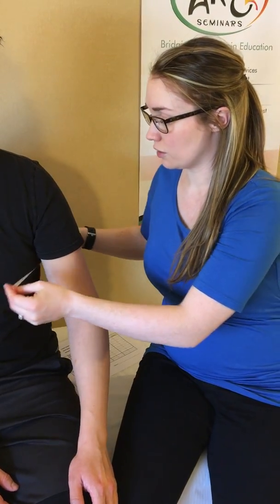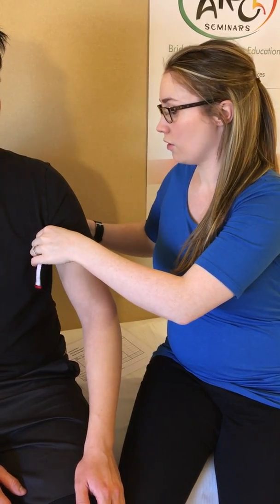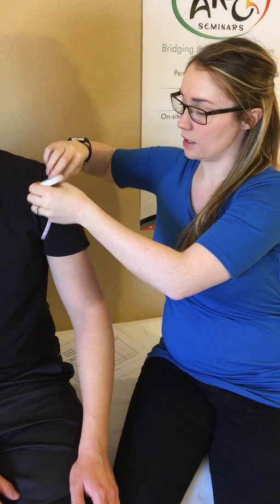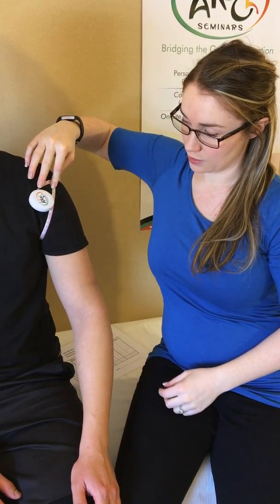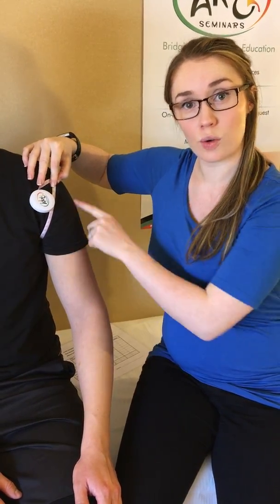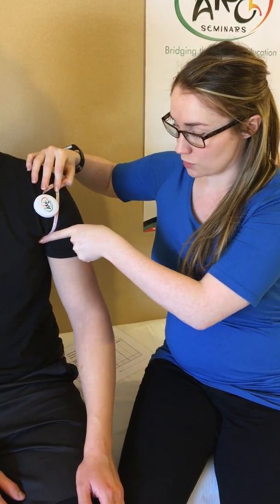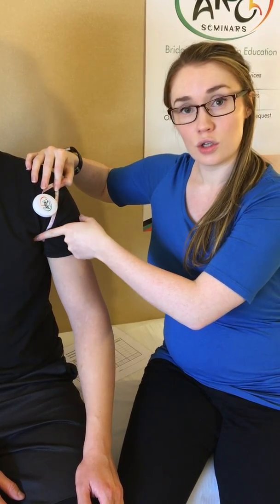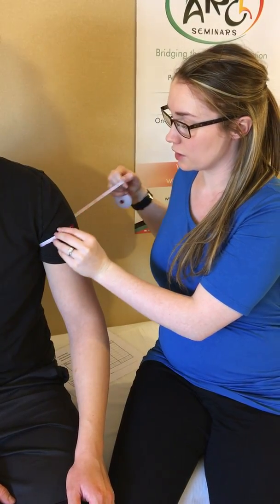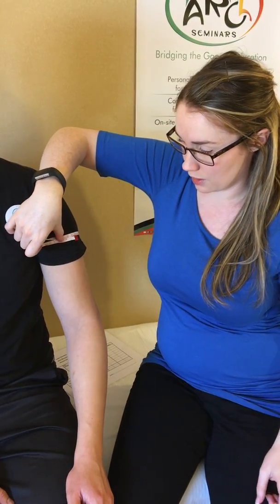Lastly, we measure at the axilla. When you're measuring at the axilla, you want to get as far up into the axillary region as you can, but you don't want to measure diagonally across the axilla like so. This is a hard measurement to be consistent with if you're going diagonally. Also, if you are measuring for a compression garment, a compression garment will stop parallel to the floor. So you want to measure your patient's girth in the axilla parallel to the floor, like so.